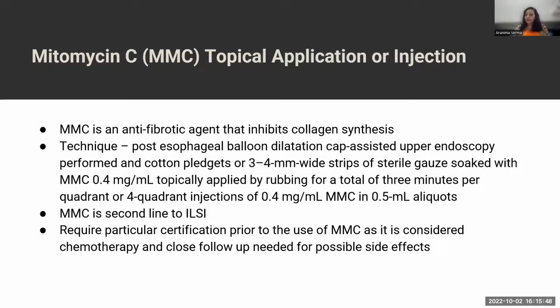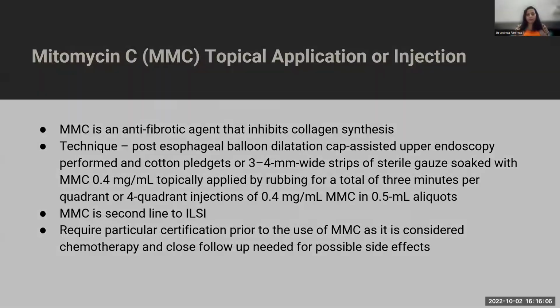Coming to mitomycin C injection, it is an antifibrotic agent that inhibits collagen synthesis. And here again, either the rubbing technique or the injection technique can be used. It is second line to steroids. But it requires a certification because it's a chemotherapeutic agent and there are multiple side effects as well.